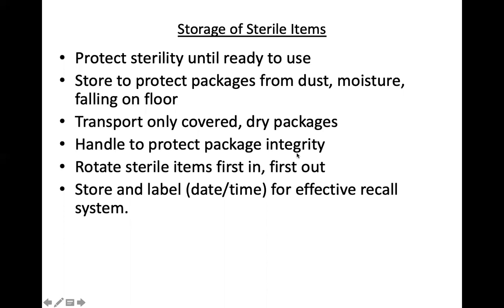They can have seals. So once you break the seal, somebody knows that you have opened it. Rotate items as first in, first out. Therefore, you have to label them properly. If you need to have a recall because of a breach or failure in the sterilization process, then you should have properly labeled them with the date and time, okay? So that is sterilization.